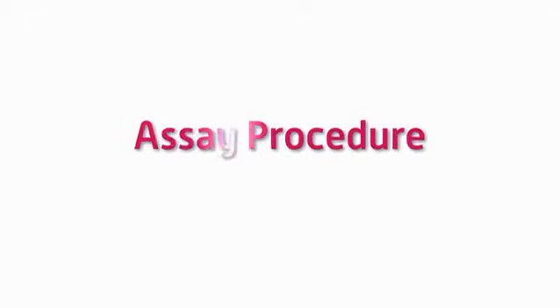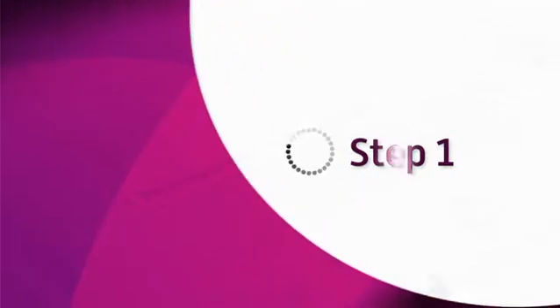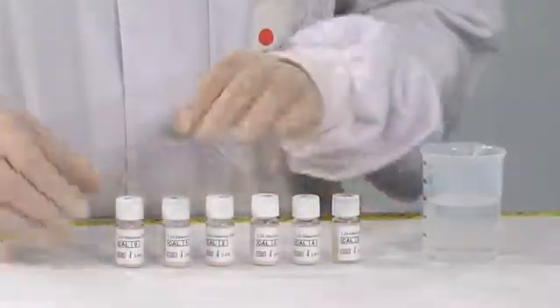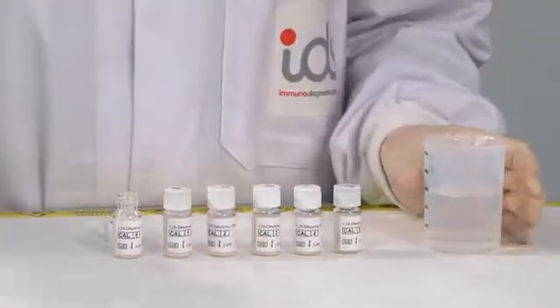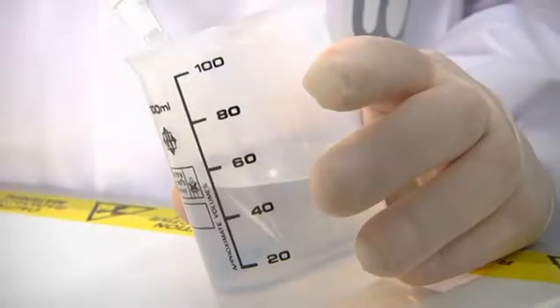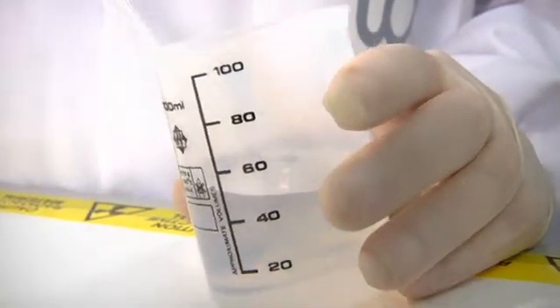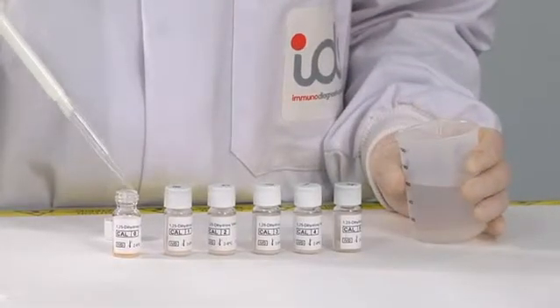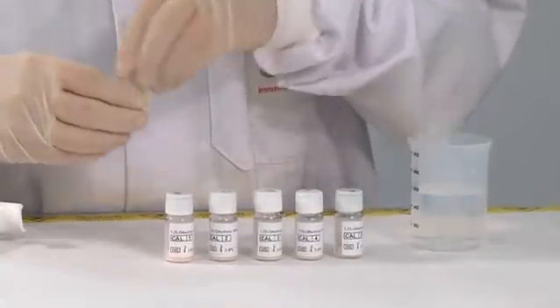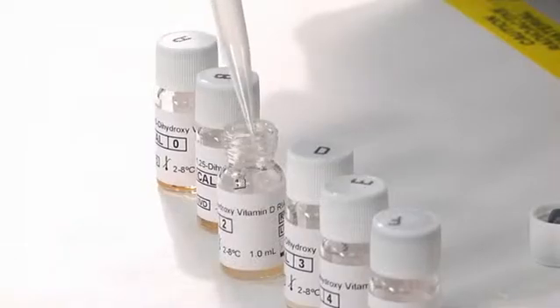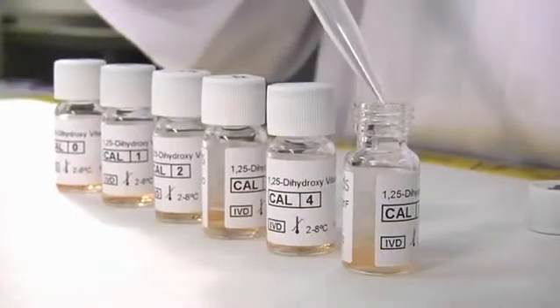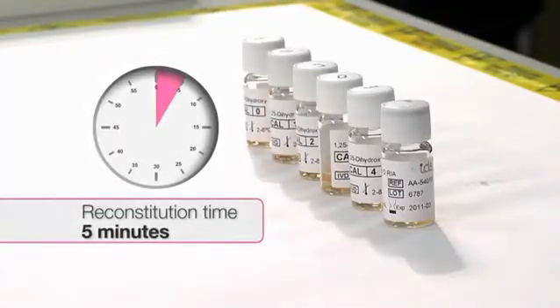Assay procedure. Step 1: Reconstitute calibrators immediately before use. Add 1 ml of distilled or deionized water to each vial and replace lids. Wait for 5 minutes to ensure calibrators are fully reconstituted.